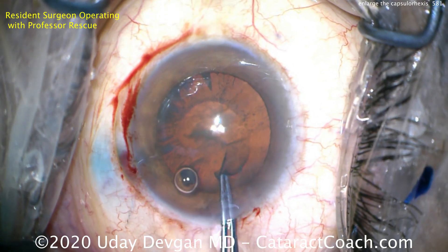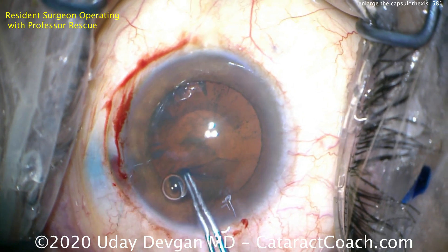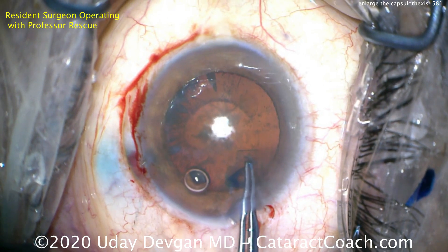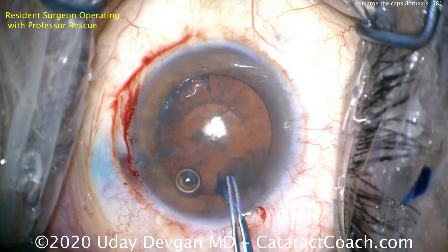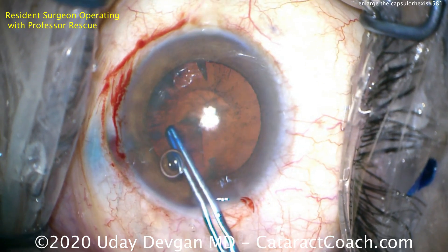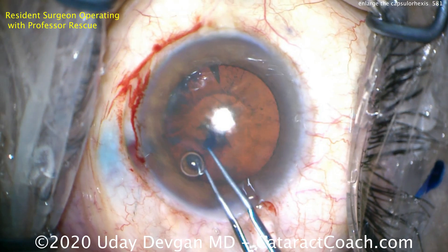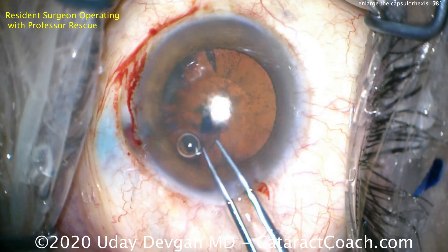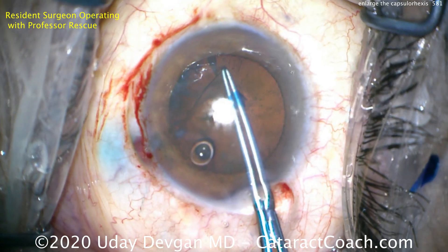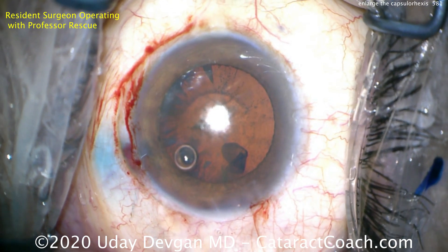The capsulorrhexis is going to be very small because they think that provides a larger margin of safety. The problem is the cataract is very large — nine or more millimeters in diameter — and you have to remove it through this tiny four millimeter capsular opening. That's going to be a challenge. Also, this capsulorrhexis is asymmetric, not well centered, and it's going to overlap the optic irregularly. This is just not ideal.